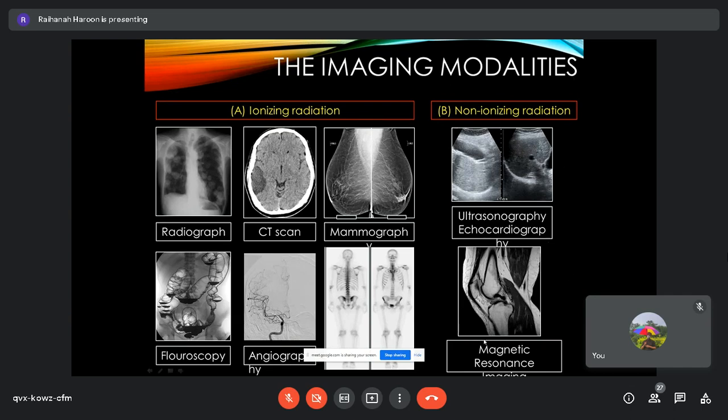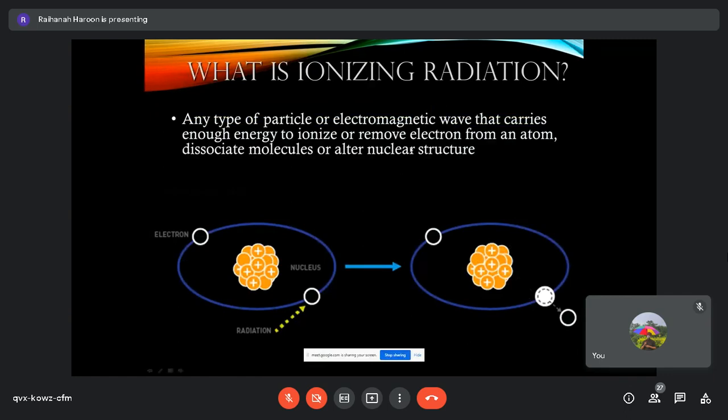And as opposed to that, the principle of MRI is not radiation. It's about a strong magnet, a strong magnet that spins all your hydrogen, oxygen. Because all these have different molecular weights, they spin differently and then return signal differently. But the principle is not radiation; the principle is basically magnets. This will give you hyperintense signal, hypointense signal. Okay, remember that.